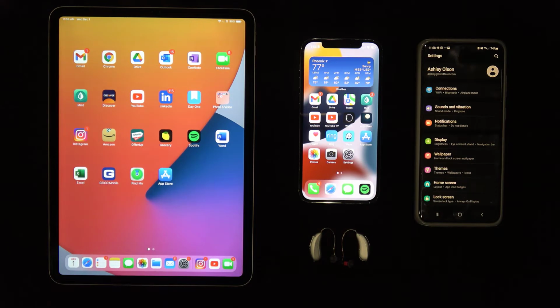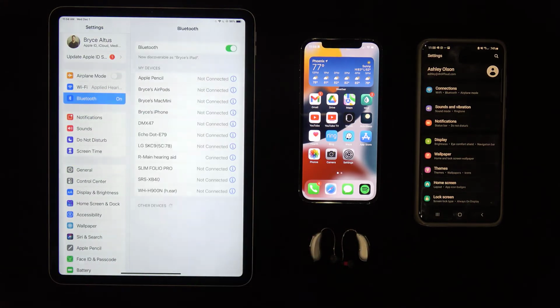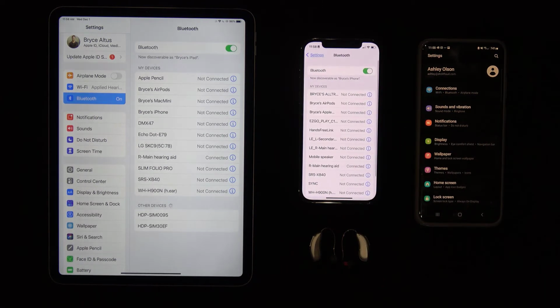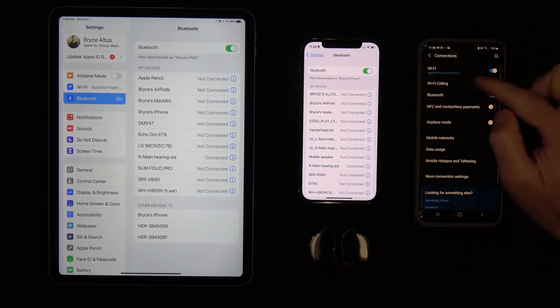To see which devices we are actively connected to, we first need to go to the Bluetooth settings of each of these devices. Tap on Settings, then tap on Bluetooth for iPhone and iPad. For Android, tap on Settings, then tap on Connections, then tap on Bluetooth.